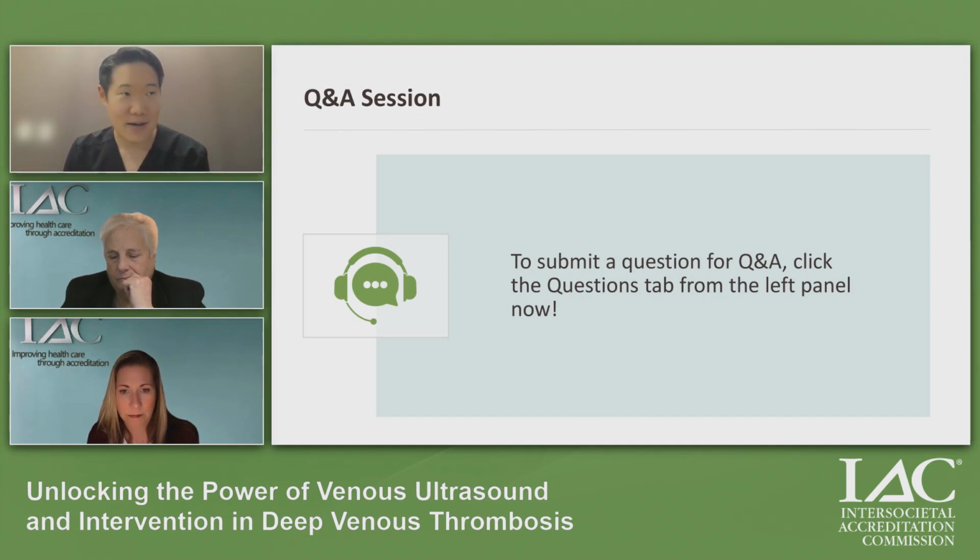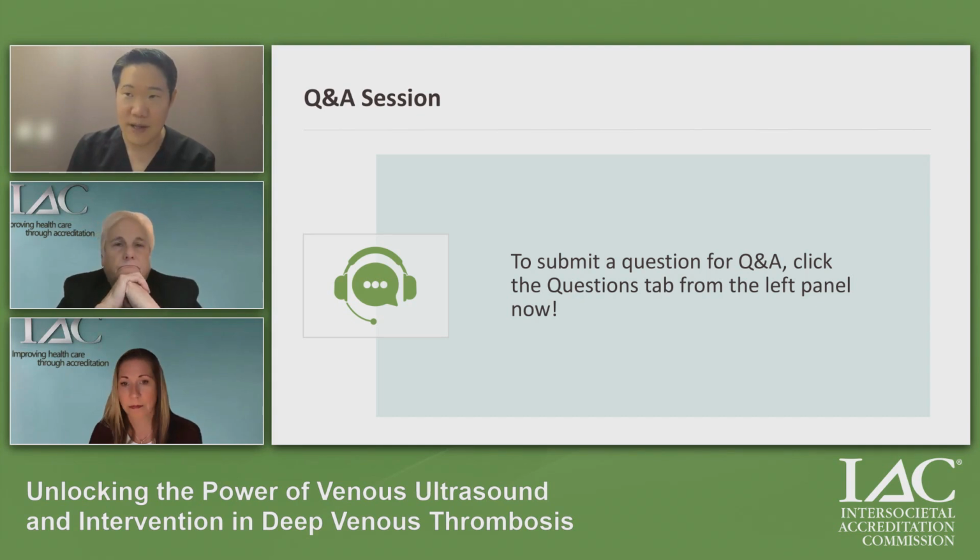If we go back to that one slide and that teaching point about how the clot changes and evolves rapidly over time, what we have seen is that as clot changes from more of that hyperacute, hypoechoic, almost mobile feeling defect within the vein into more of that chronic looking, hyperechoic, fibrinous appearance, often with scarring and shrinking of the vein, as it makes that transition, it turns into much more stuck. It turns into much more of a permanent type of object within that vein.